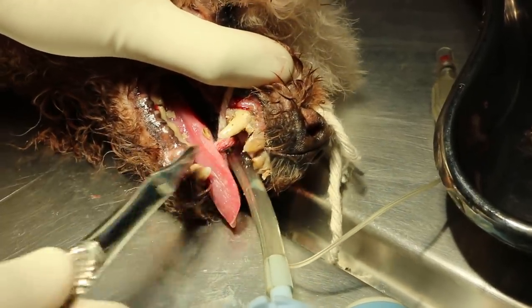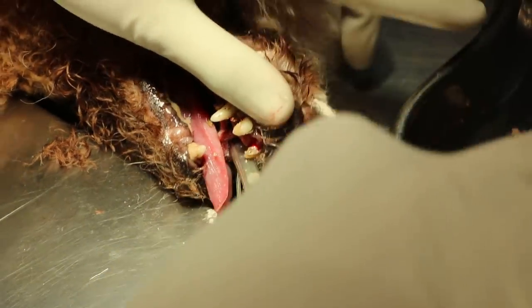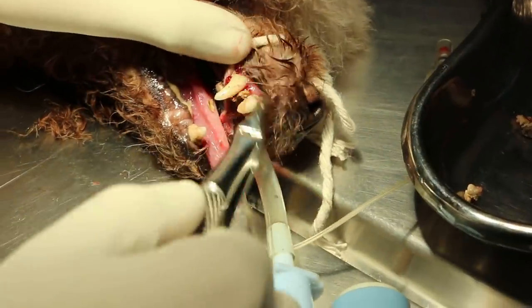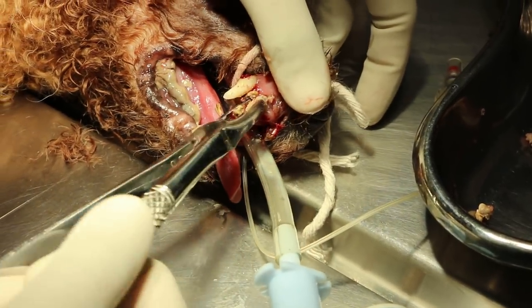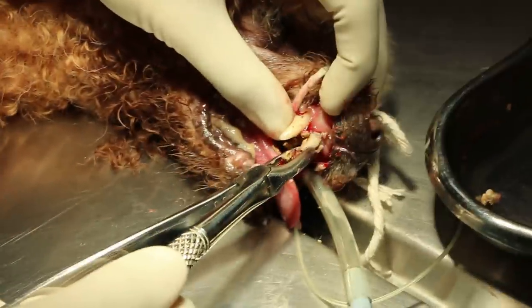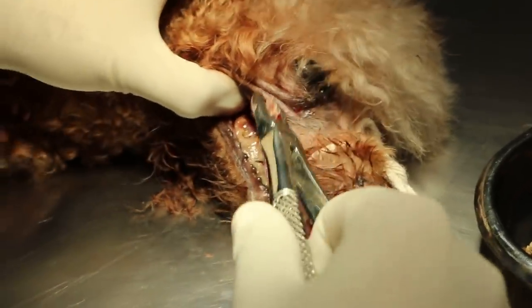There's the canine. Canine seems to be okay. Then incisor — right upper. Check carefully first. So we finish on the top first. This one is loose — turn it a bit, it can be done. Okay, so this is the first one. Now we go over to the other side.